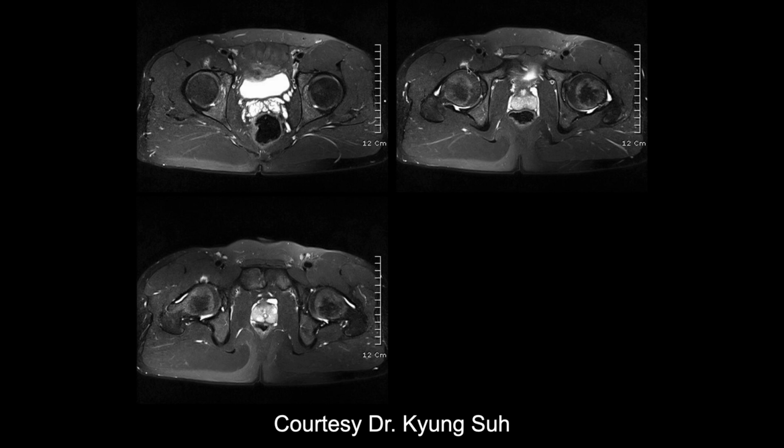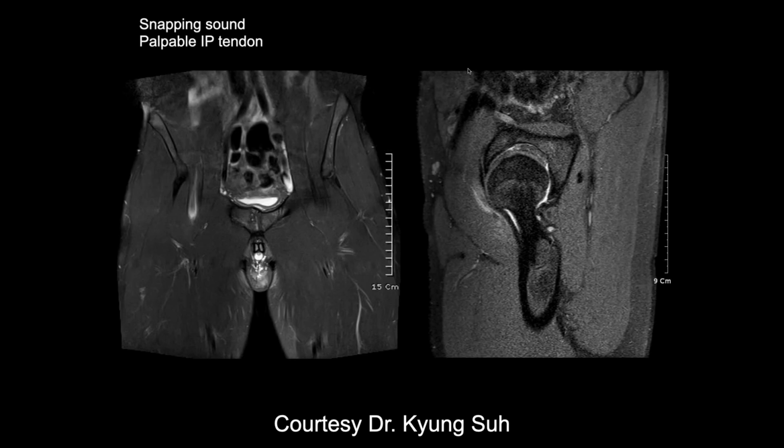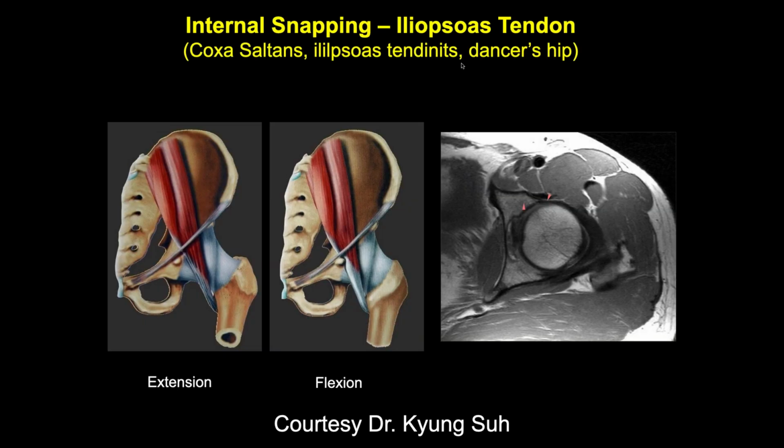Is this like a snapping, internal snapping iliopsoas tendon pathology? And the person feels a snapping when they move their leg. This is what's called snapping iliopsoas syndrome. And it's just showing a little bit of edema right where it's irritating it. It's also called coxa saltans, iliopsoas tendonitis, and it's also called dancer's hip. Different names for it.